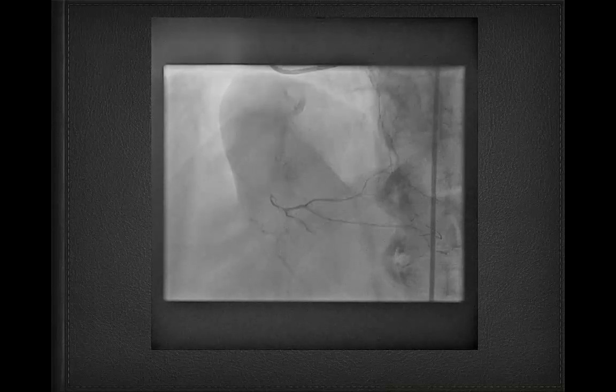You can see the Cyan Black now is reaching the distal part of the RCA. Micro 14 is coming. Is that your go-to wire for retrograde crossing through septals? Now, yes. First it was the regular Cyan, but now Cyan Black is more slippery, and for epicardial channels also, it's very good.